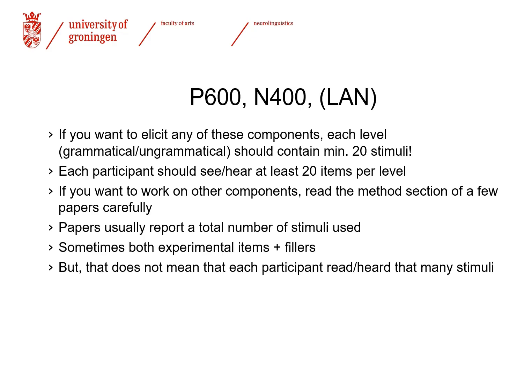When it comes to the MMN, just to illustrate the difference, unlike P600 and N400 studies, an MMN study may work with hundreds, if not thousands, of stimuli.